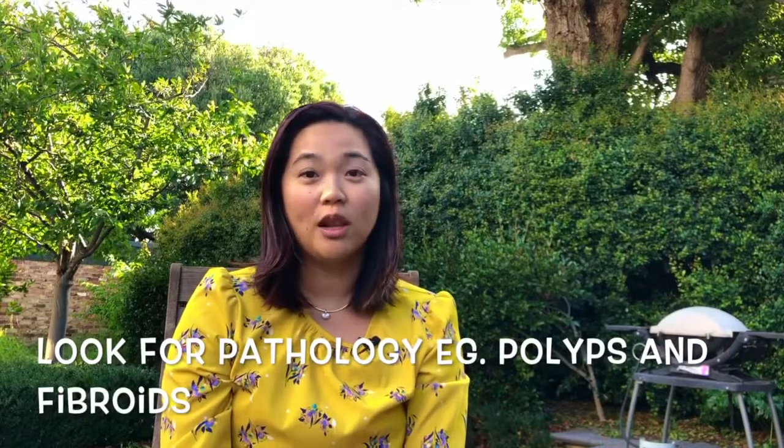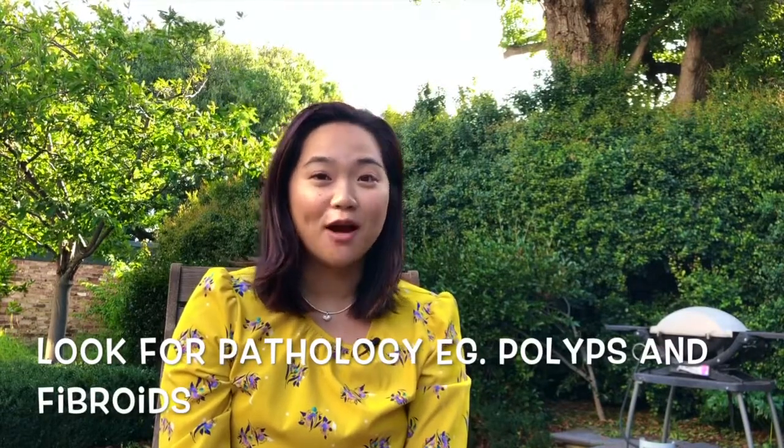We usually do hysteroscopy when we need to go inside the uterus cavity to have a look at the lining of the uterus, to look for lumps and bumps such as polyps or fibroids. And that's the hysteroscopy procedure.